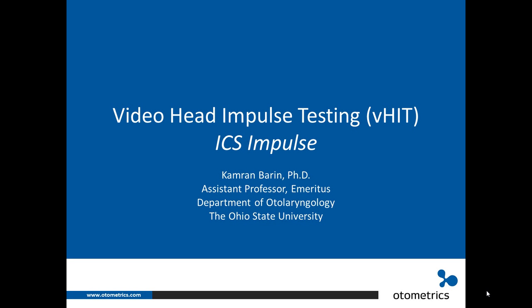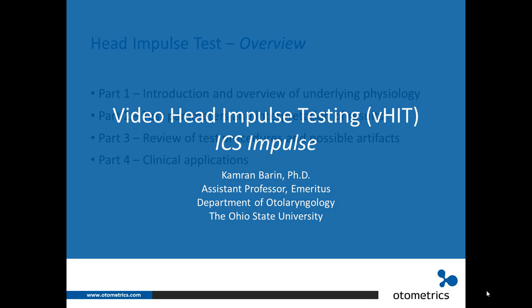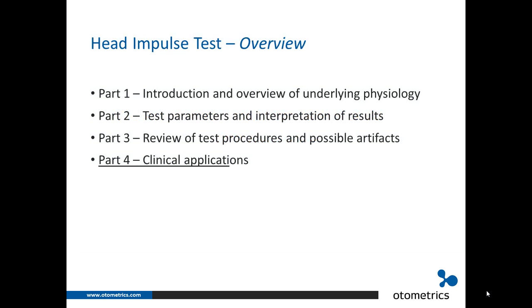This is the last part of the video series on head impulse testing. Part 4 describes the application of VHIT through a series of clinical examples and provides a comparison of VHIT with other vestibular function tests.